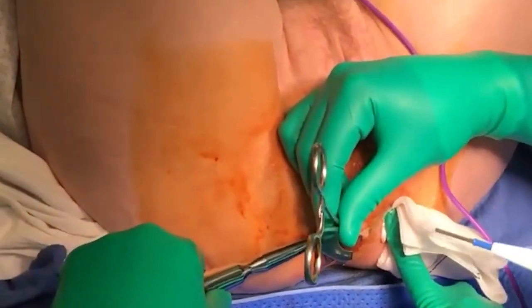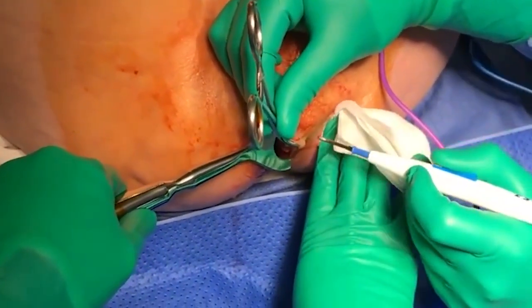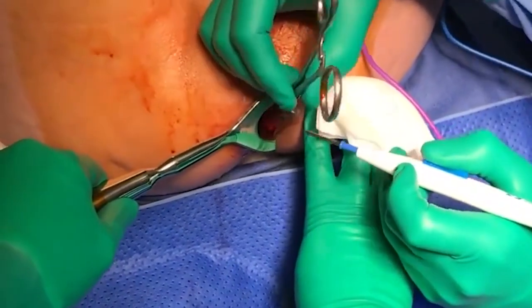Surgical intervention procedures for hemorrhoid disease are typically employed for patients who experience significant and debilitating complications or whose frequent and bothersome prolapse causes them persistent and ongoing problems. Surgical procedures are considered the first and standard method, so to speak. The procedure we call hemorrhoidectomy means removing the hemorrhoid that is problematic. For years now, efforts have been made to change this method and adopt simpler approaches.